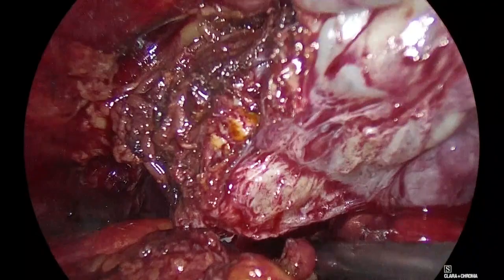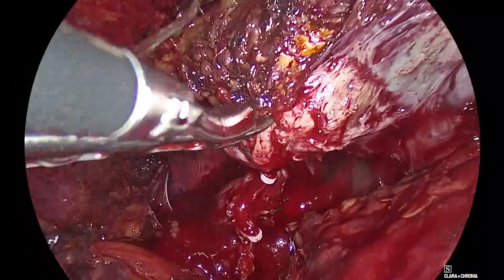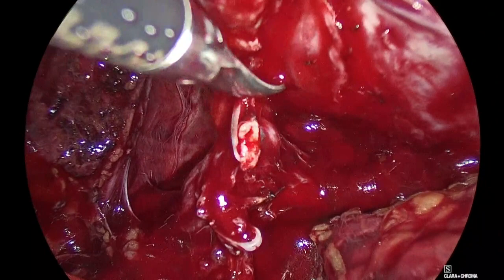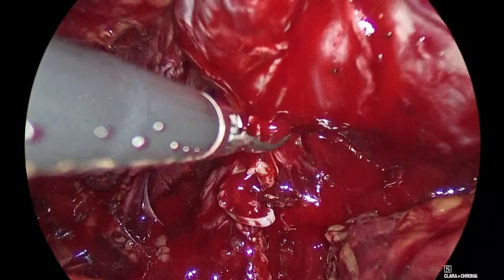Stay outside, Panagiotis, there. Yeah, the same experience, the clips fall off. I don't like it. There's no sense in putting the clips at the end. So that's very nice here. Nicely seen. Give me the duck, please.